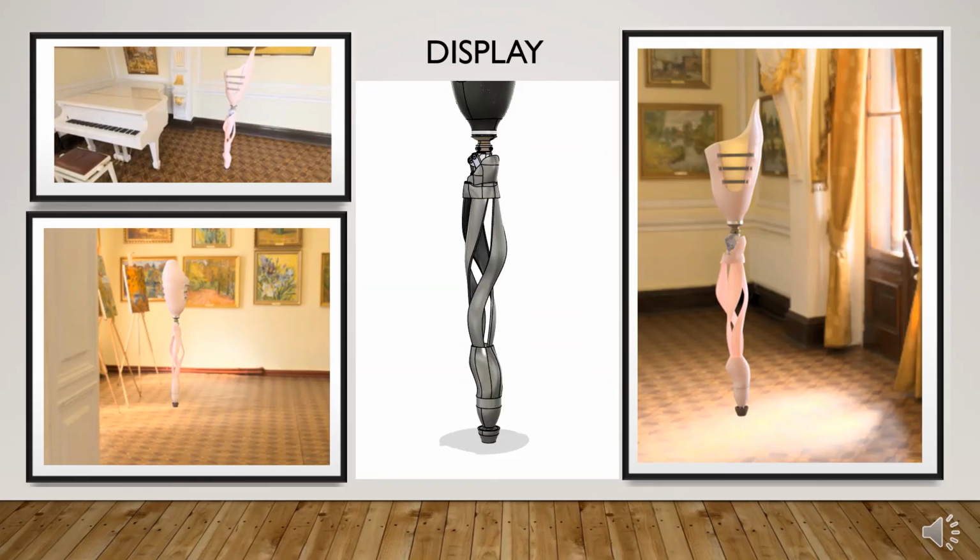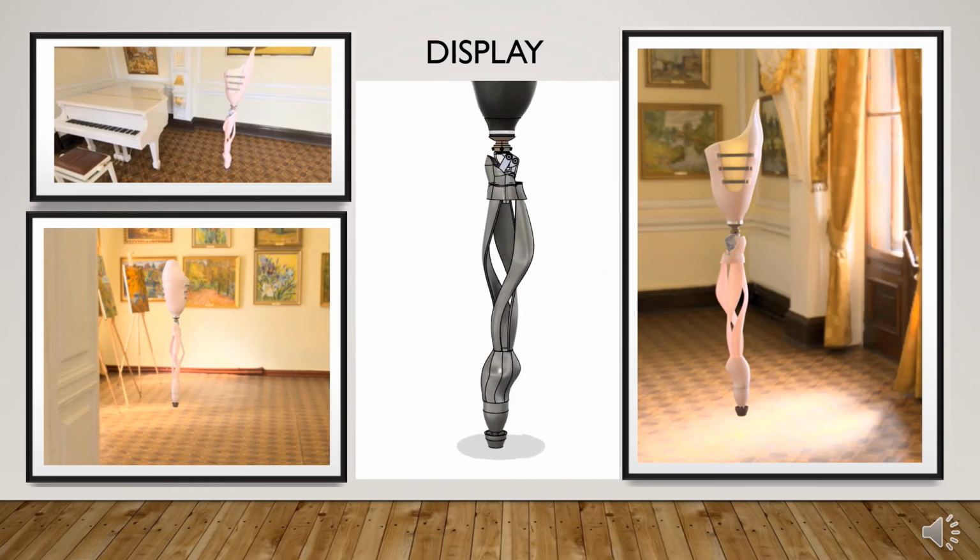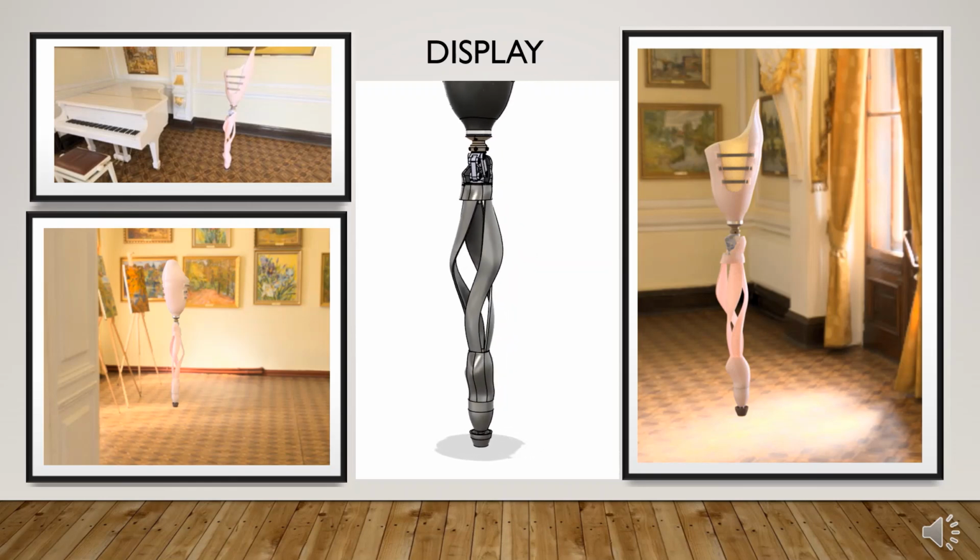This is how the prosthetic should look like in a dance hall, with the toe tip matching the floor. Combined with the spirals, this would contribute to the illusion of the ballerina being floating, which is one of the objectives when going at the tip of the toes.